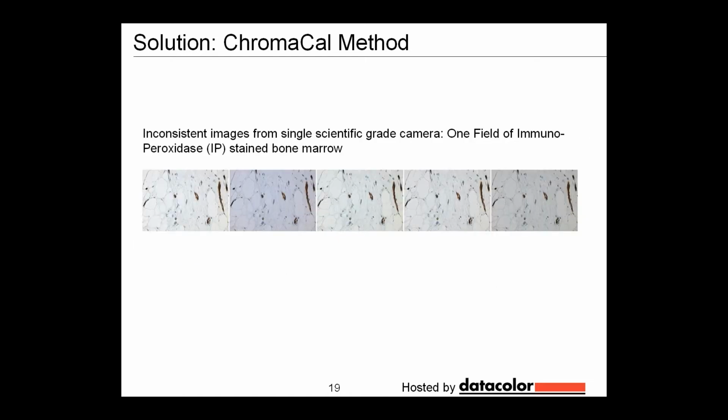So here is a series of images. These are immunoperoxidase stained bone marrow, and in this series of images you can see that there are some inconsistencies in the images that were taken. The first image we'll call the day 1 image. The images that follow vary from that image either by exposure or by the color balance.